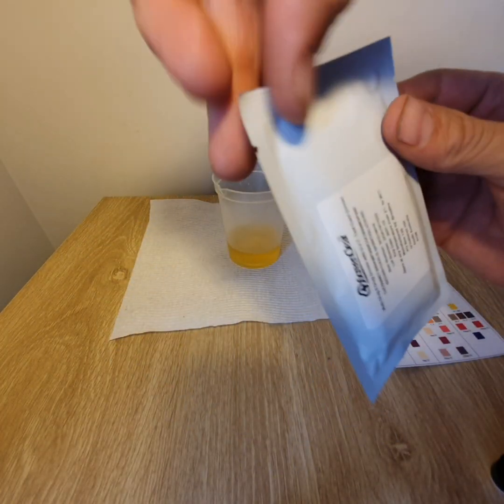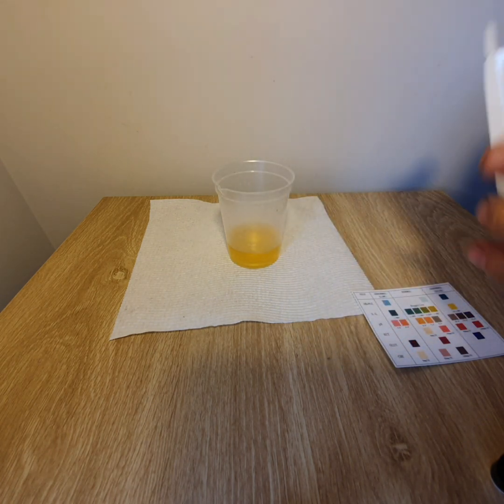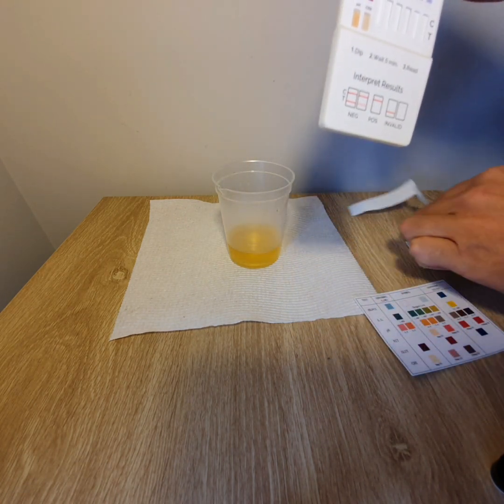So first things first, we need to check the expiration date, make sure that's within limits, and if it is, go ahead and open the foil packaging and reveal the six-panel test card here.